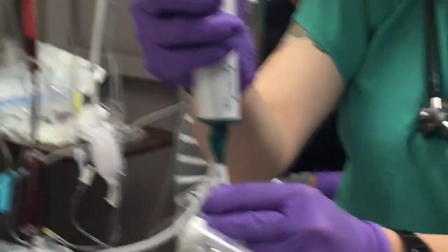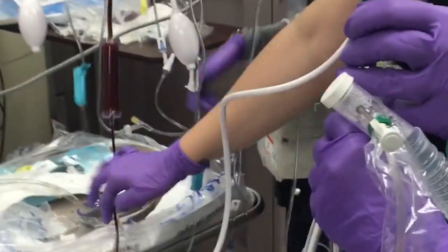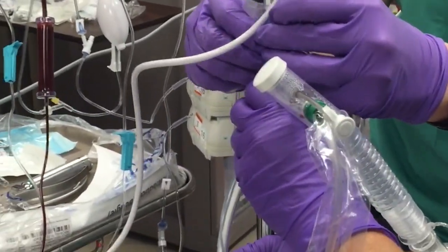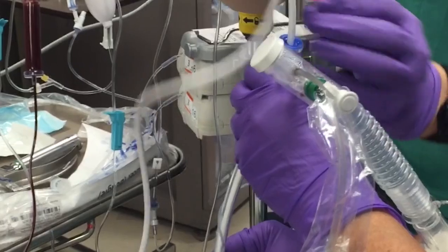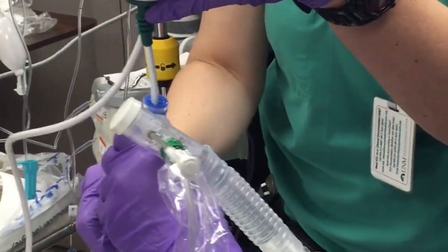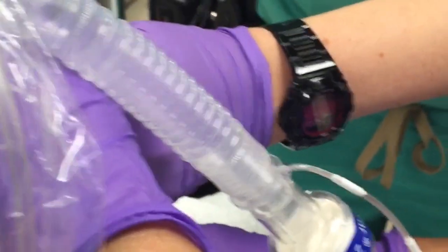At that point, undo your balloon — take the air out of your balloon, not the LMA balloon. Now slowly advance your tube. Keep your scope where you can see your view, and just advance your tube.